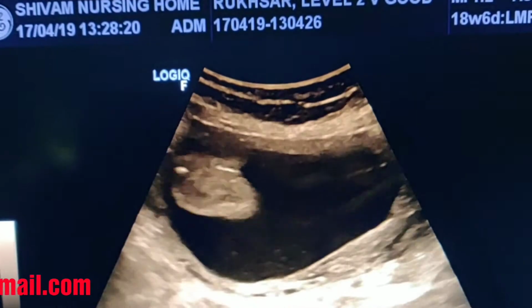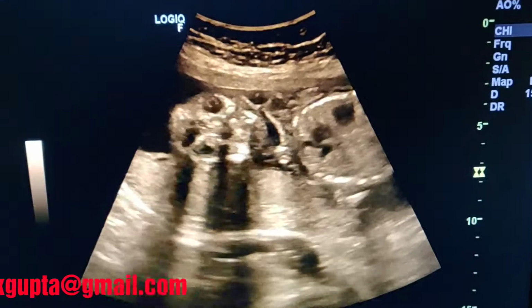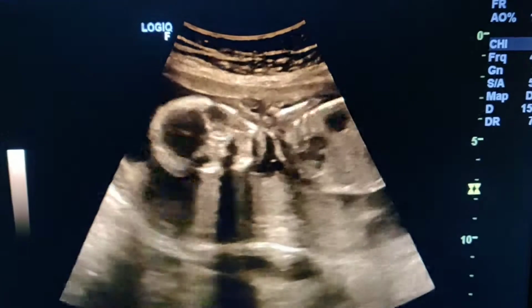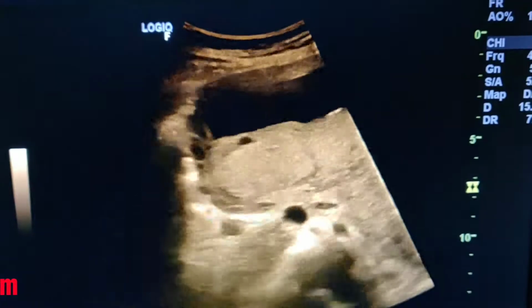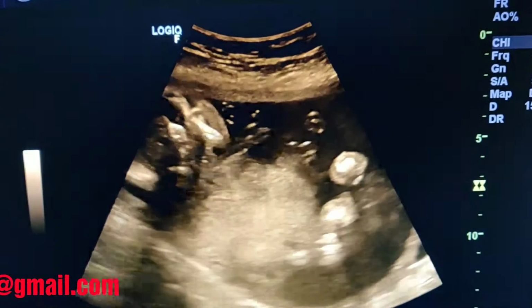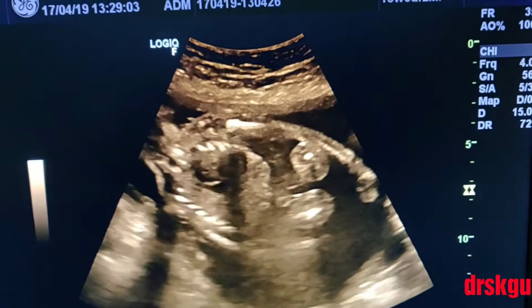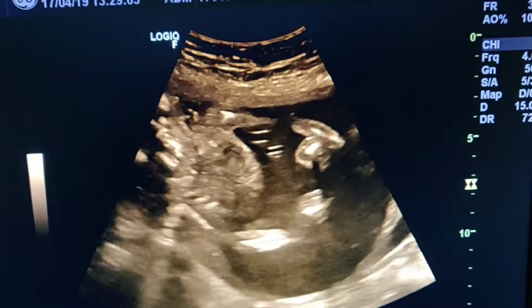Again, emphasis on the feet of the baby. You see the cross-legged baby. The clip again showing the fetus face in the coronal view, the head, the lateral ventricle should be seen posteriorly, and the size should be measured in a view when the thalamus is visible, slightly tilted view from that view, and the horn should be measured at the level when the choroid plexus ends.